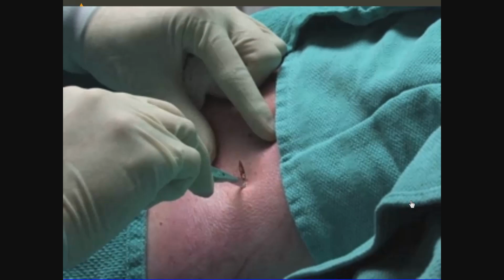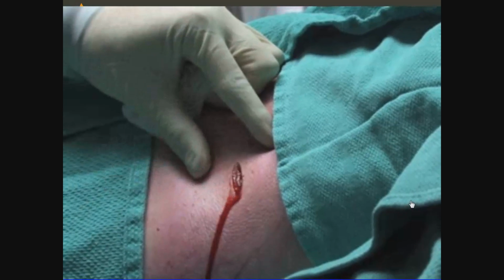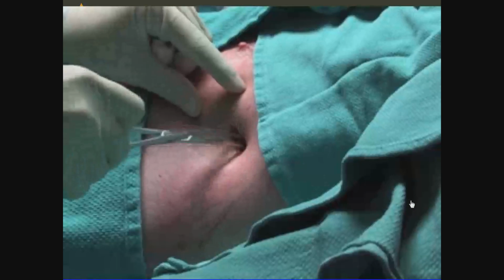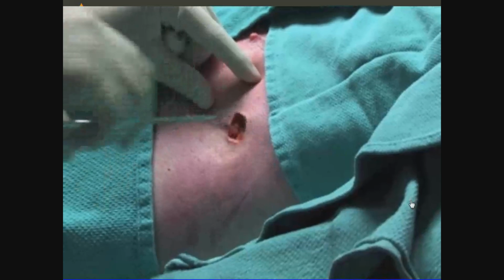Make an incision approximately 1.5 to 2 centimeters in length above and parallel to the anesthetized rib. Introduce the curved dissecting instrument, such as the Kelly clamp, into the incision. Begin dissecting the subcutaneous tissues in order to reach the intercostal muscles.